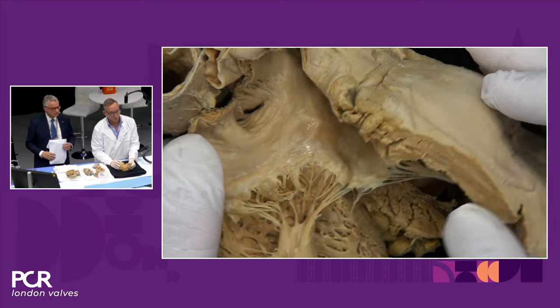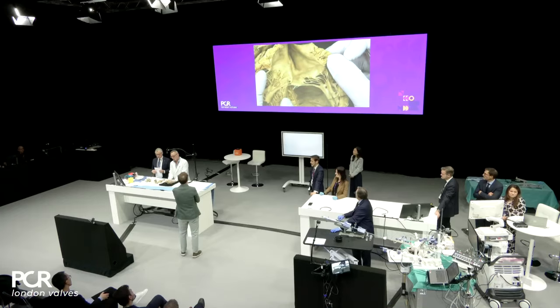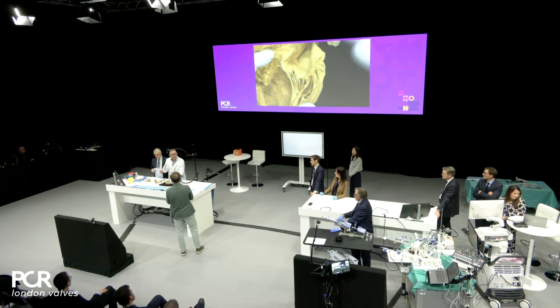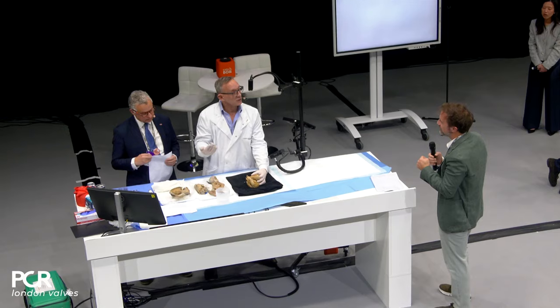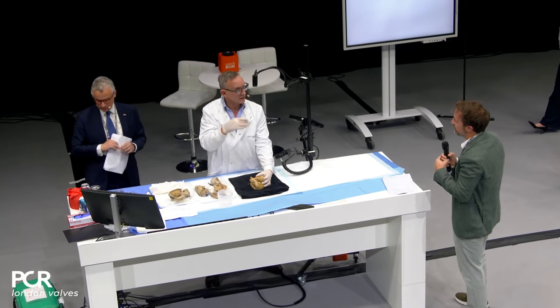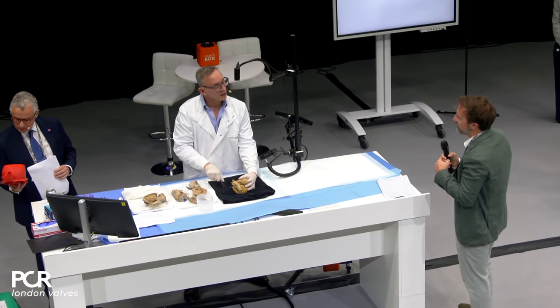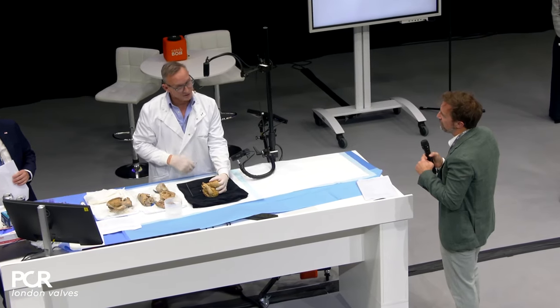Andrew, yes, a quick question, because this is something for the practice. The mitral leaflets look a bit thicker than the tricuspid ones. Is that right? That's an acquired pathology. They start off as really thin, of equal thickness. And yes, then you'll see them thicker on the mitral side. You'll see that with the hooded regions, much thicker. Now, you can of course see that on the tricuspid as well, and that tends to be in the cases with tricuspid regurgitation. So you see thickening and hooding on the tricuspid side in the severe end of disease.